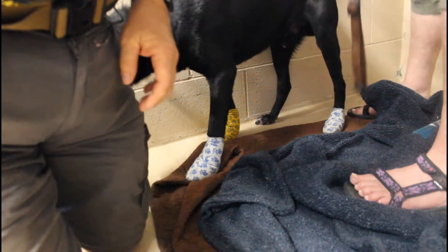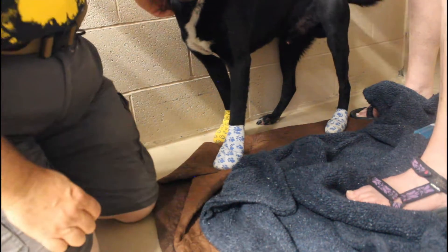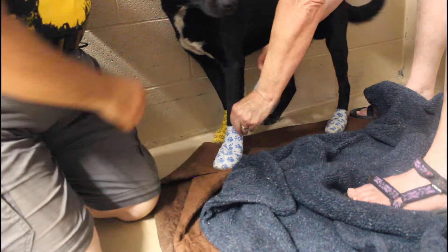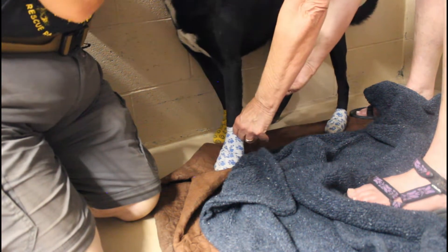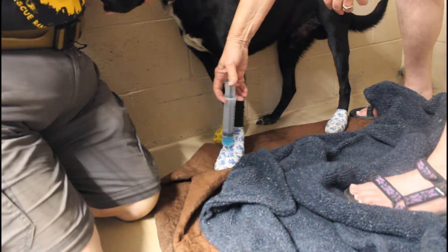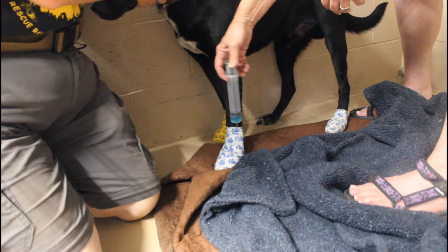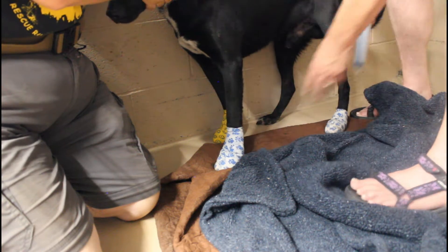Do you want to put silvadine on his wounds so it doesn't stick? This stuff can still stick a little bit. If you just stick it in there, it starts to kind of squish around and spread over the wound. Yeah, get some more.